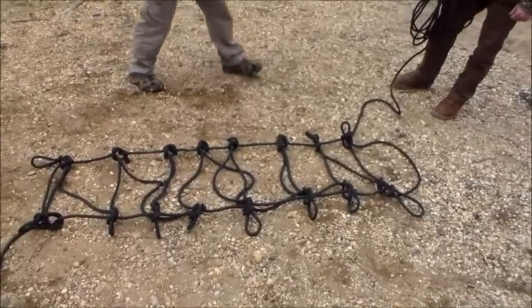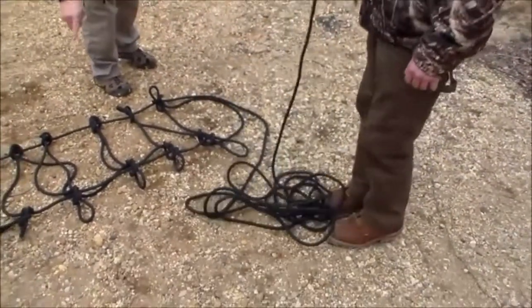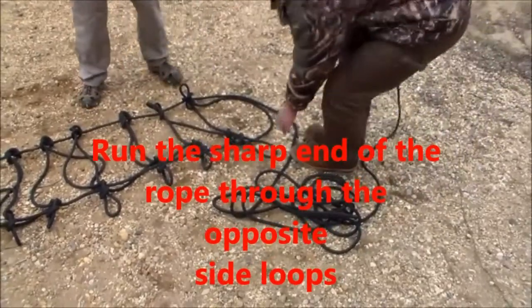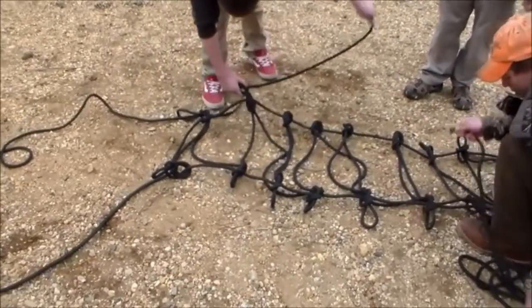The construction is almost complete. The scout on one side is going to loop his rope around and run it through all of the loops made with the half hitches, and the scout from the other side is going to run his rope through the other way. This will tie the stretcher together so it won't come untied.